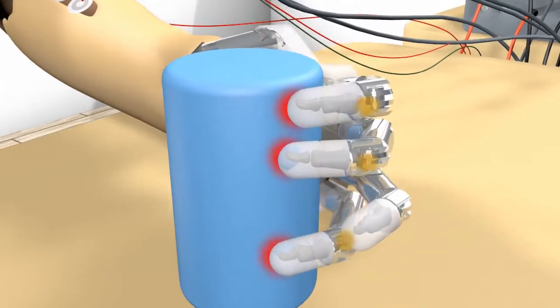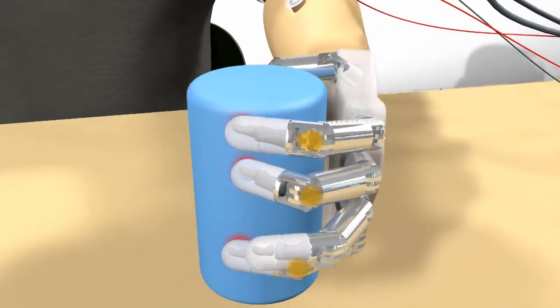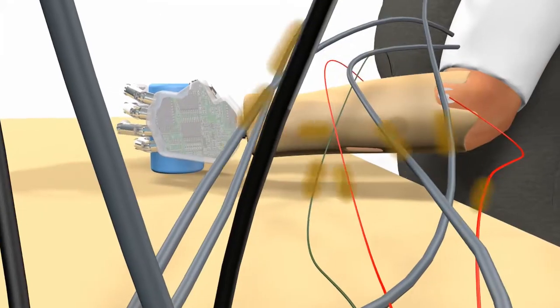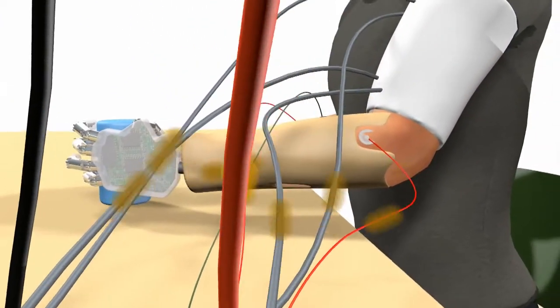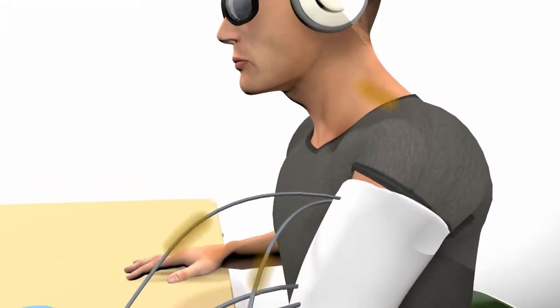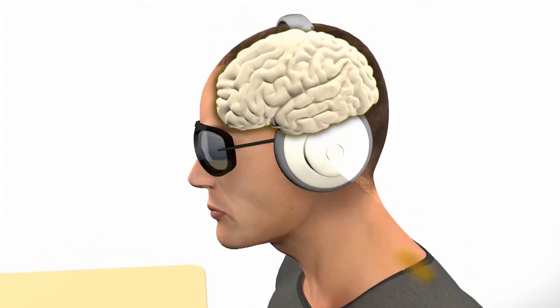Electrodes have been implanted in the median and ulnar nerves of the left arm. To feel an object that is in contact with the prosthetic hand, the electrodes deliver electrical stimuli to the nerves that were proportional to the finger sensor readouts.